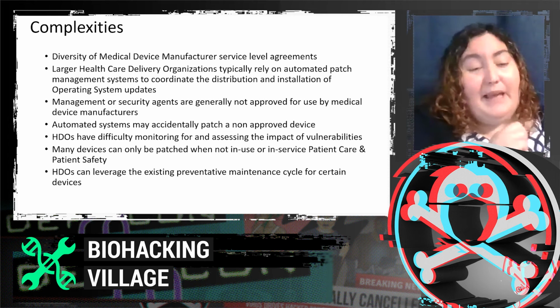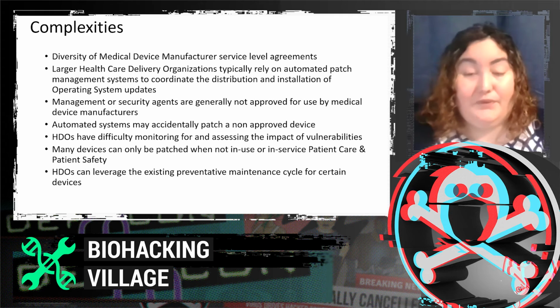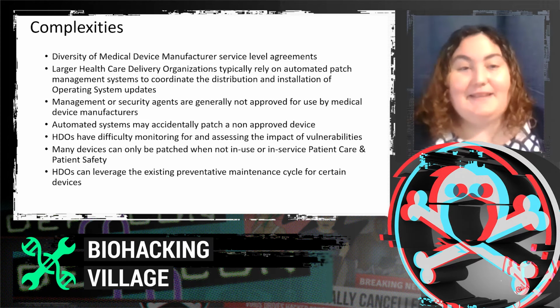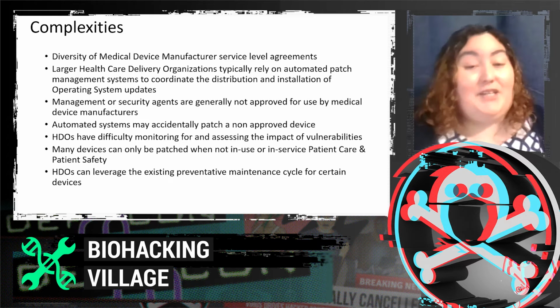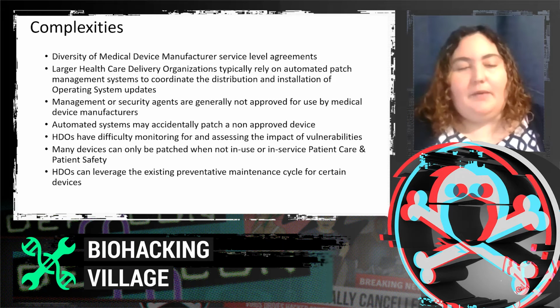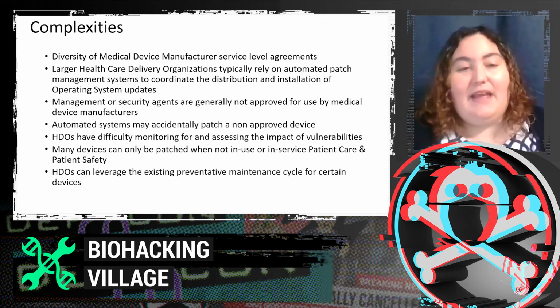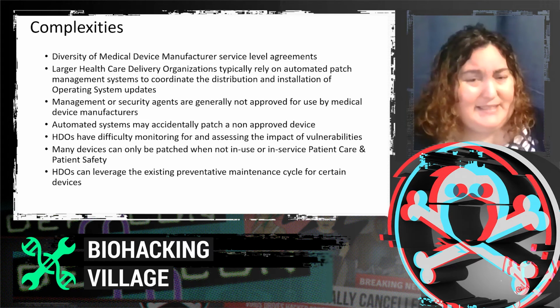These agents for these programs, or security agents, are not generally approved for use by medical device manufacturers. Automated systems might accidentally push a patch to a non-approved device, and that patch might bring that device offline or render it unreliable.